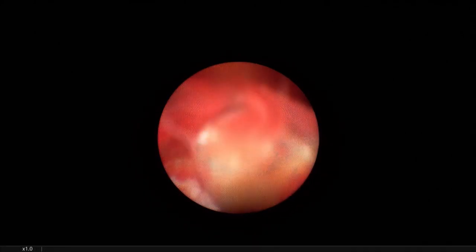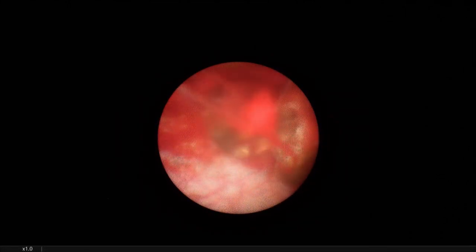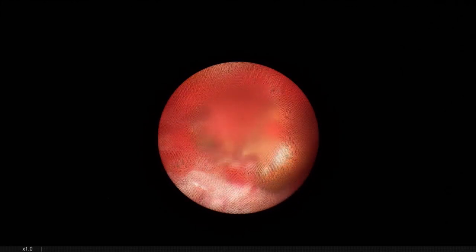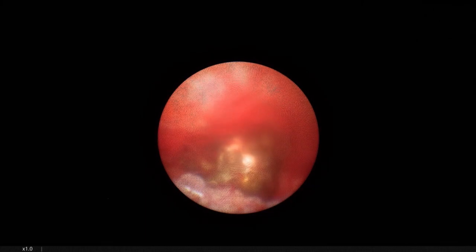The sensitivity of the camera is so severe to hematuria that you only see red. Laser on, please.